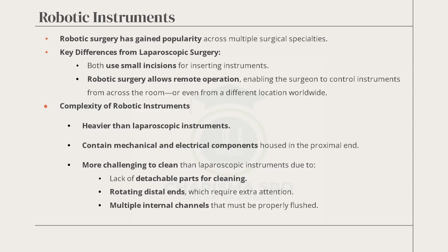They connect with electricity, and they have a lifespan of uses. On them there is a mechanism where every use fills a spot that is a white dot. It fills gradually, and when that white dot turns red, you have to throw that robotic instrument away. It has outlived its usefulness. It will not fire. If they press the button for it to work, it will say, I'm not working today.